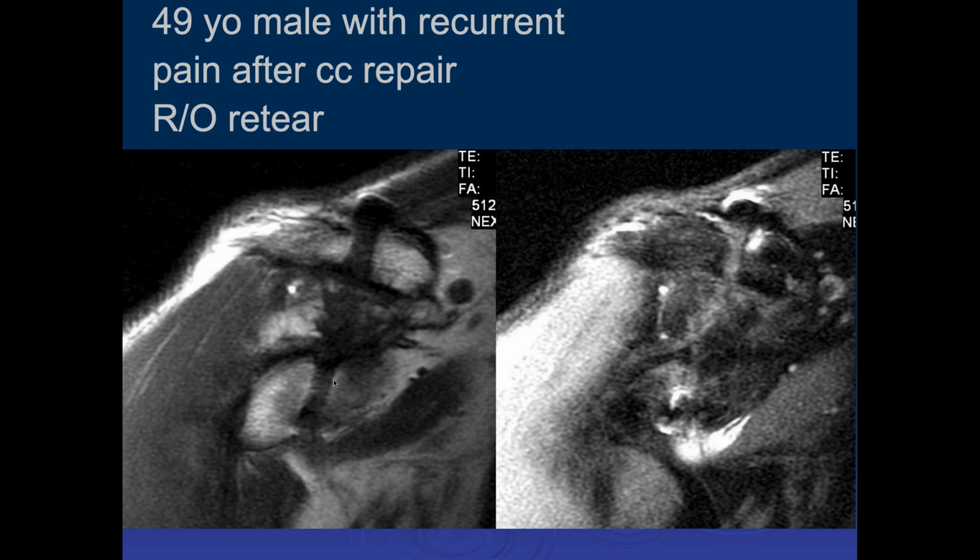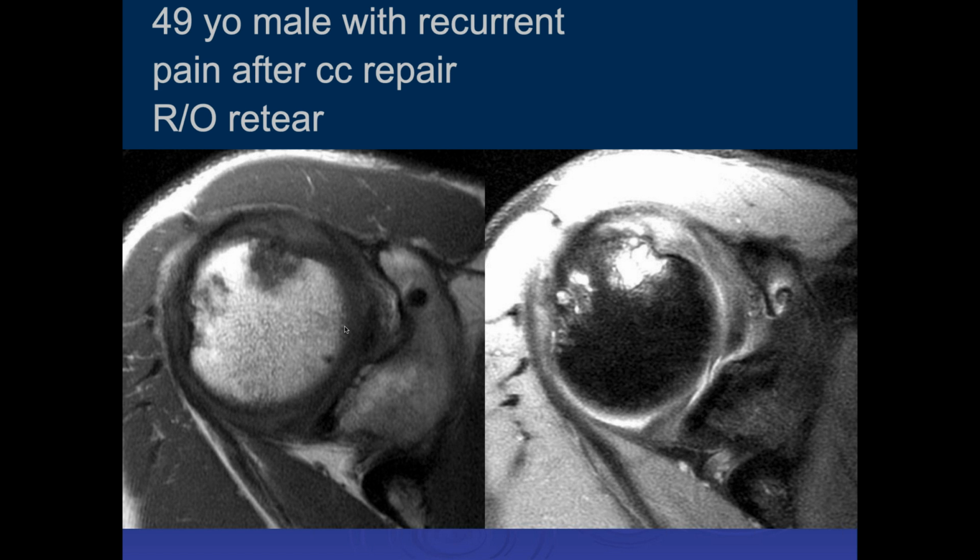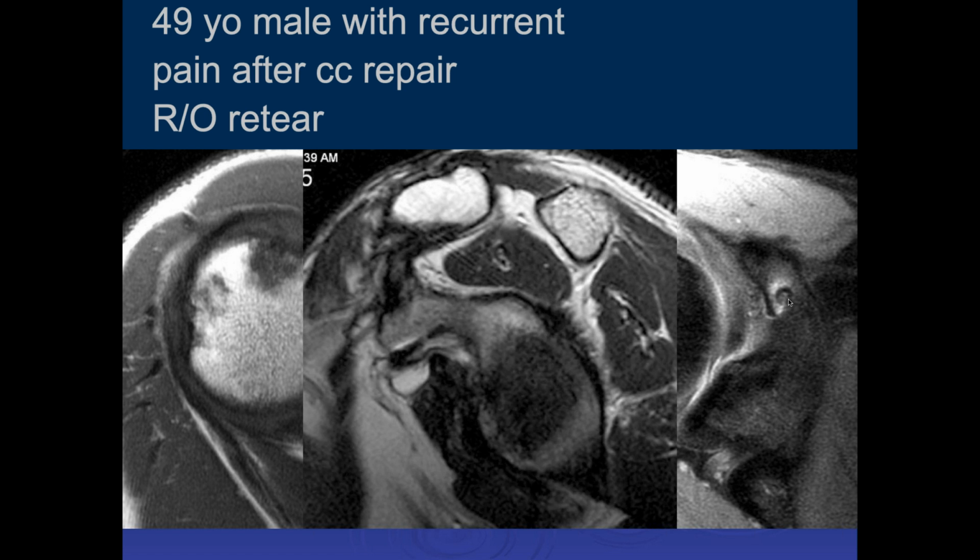This was a suture. The fact that you see it separated, that's why we have so many different operations, because there's not a single operation that works 100% of the time. Yeah. So you choose the one that works the best for you, and that's the one you use. Yeah, and here we can see the hole there.